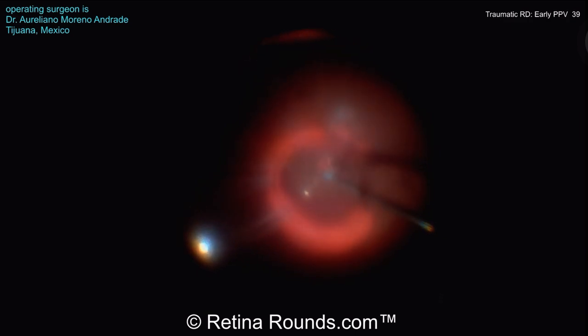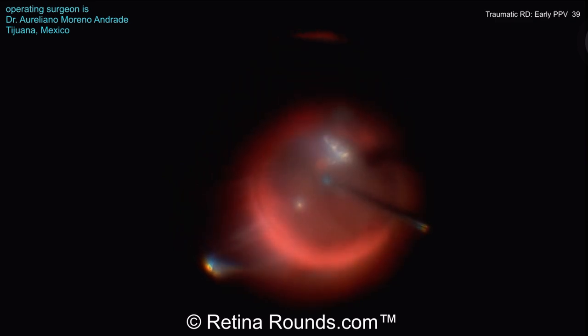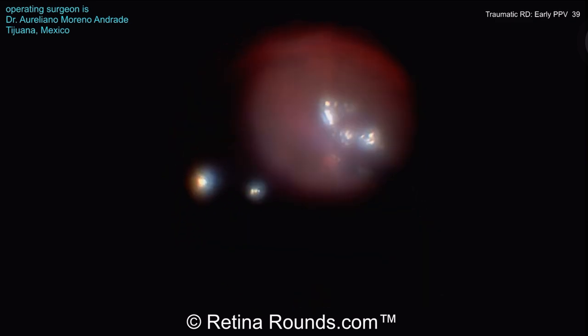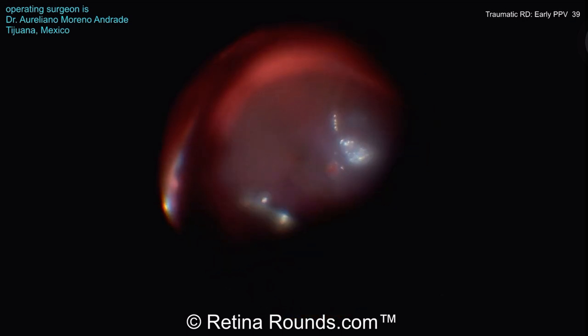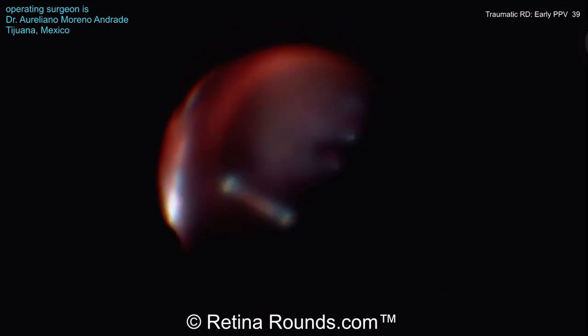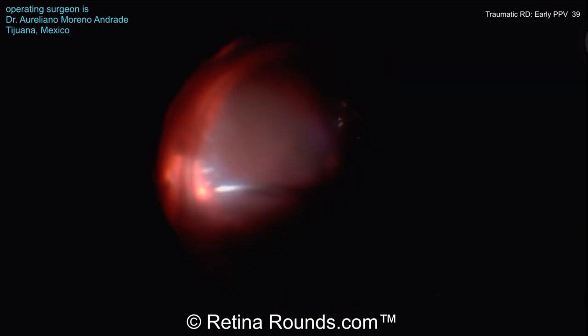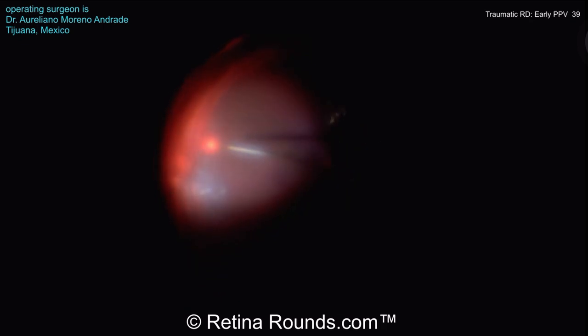And now Dr. Andrade is putting down some perfluorocarbon liquid in the posterior segment to flatten the retina, also to provide some stability posteriorly as he's working peripherally. And in these cases where there's incarceration of the vitreous and retina in the open globe site, a limited retinectomy often needs to be performed. It looks like he's done that in this case and now is barricading this limited retinectomy with laser.